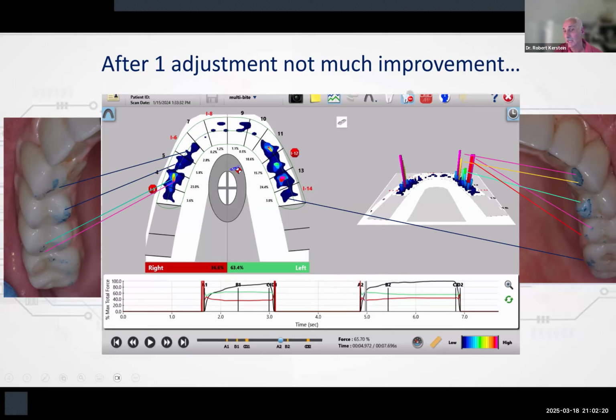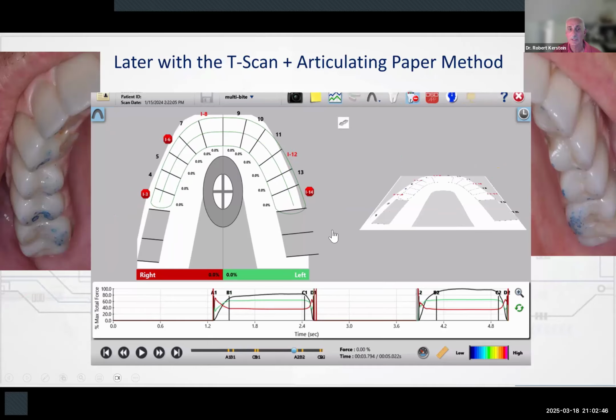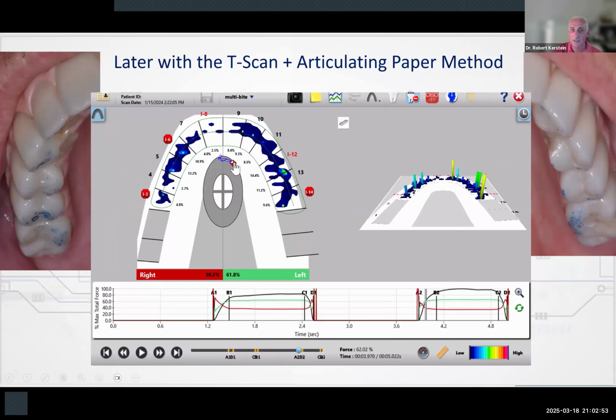So here's a really good example of how a dark mark is actually low force, right? So we wouldn't treat that, but we treat the canine. There's two moderately forceful areas. We treat the premolar. This is a really good example. Look at tooth number 13, mesial and palatal, right? Mesial and palatal, but the distal is low force. So we leave that alone. And so you become very selective about what you adjust, right? So here's a little later, we still have 3 implants under overload warning, so we aren't making that much progress, although the center of force is leaving the middle.